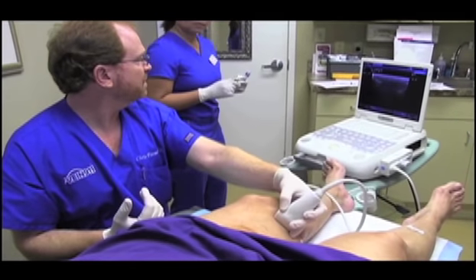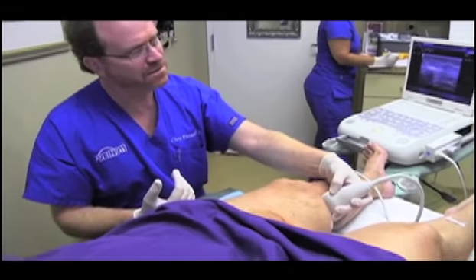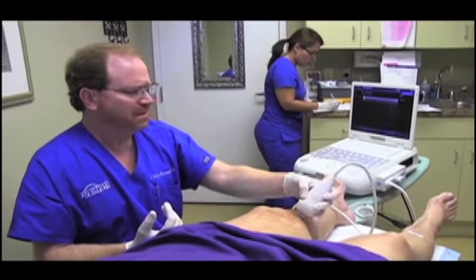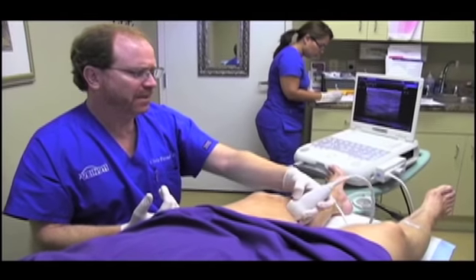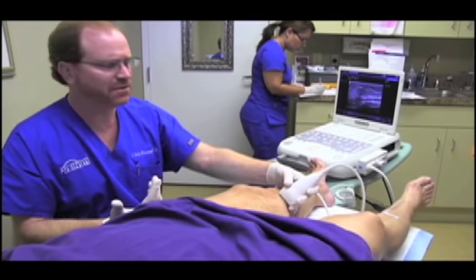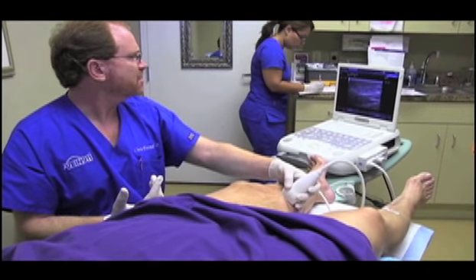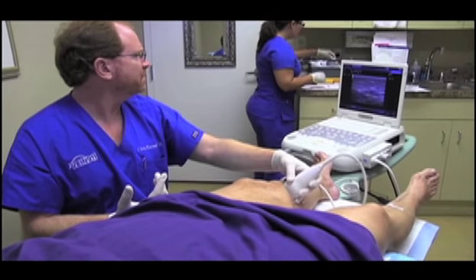So we've gone through about four cc's. Generally I'll always use less than ten cc's of foam at any one session — typically between four and eight. I might use a little less the first time I'm treating a patient just to make sure they tolerate it and do well. But because the veins are so big, we'll use more than four cc's here.